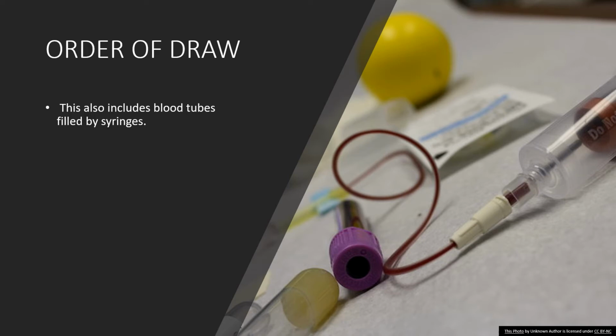and then be able to take that blood from the syringe and use a transfer holder, which looks similar to this, but it is a way for you to connect the holder to the syringe, and then it turns it into an evacuated tube system so that you then can push your tubes onto the inner needle of the holder and be able to draw the blood from your syringe into the evacuated tubes.